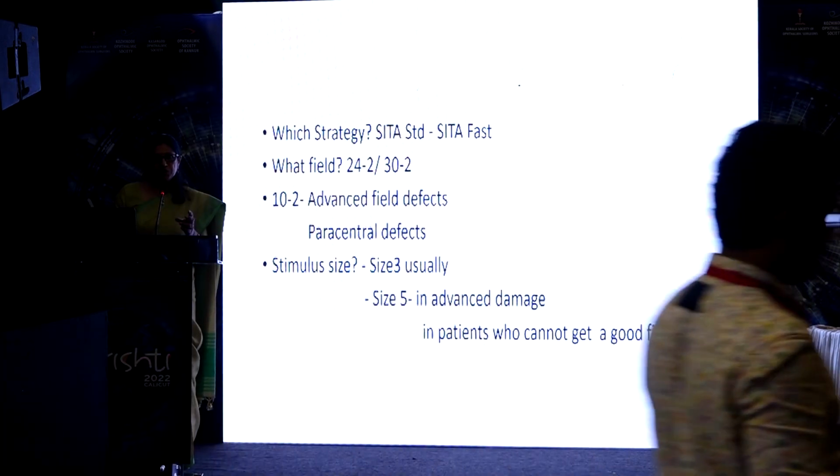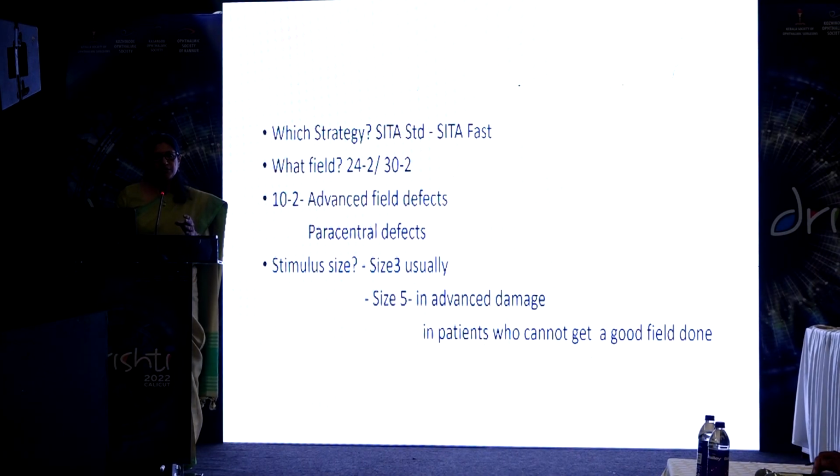So which strategy to use, either a SITA Standard or a SITA Fast, depends on what was done earlier. So don't switch from a SITA Standard to a SITA Fast, because if you do that, often you see an improvement in the field, which is not actually an improvement in the disease condition.